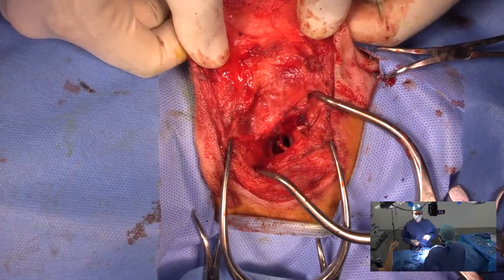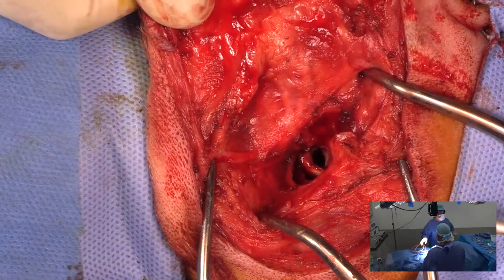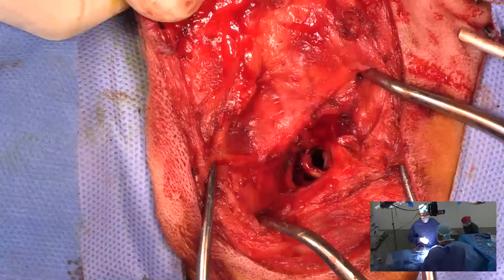Okay, that's great. All right, so now we can see the facial nerve right here. And that's the inside of the tympanic bulla right there. Either one of those. Great, thank you. See how close that facial nerve is to the opening of the ear canal? So the facial nerve is right there coming out of the stylomastoid foramen, and the ear canal is just sitting right in there. So that is bloody close.